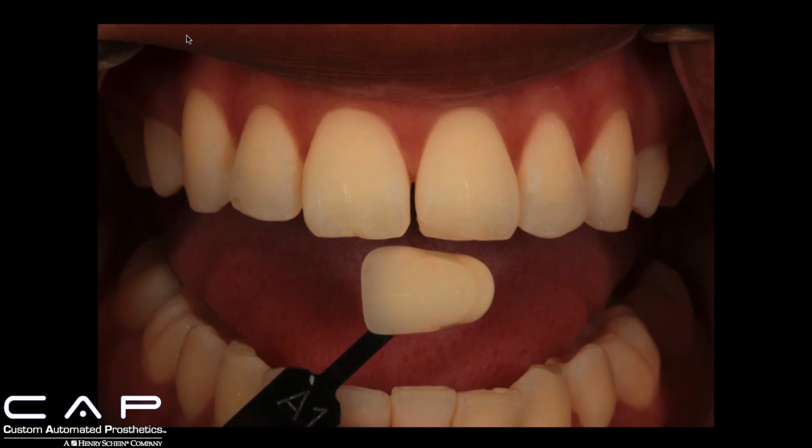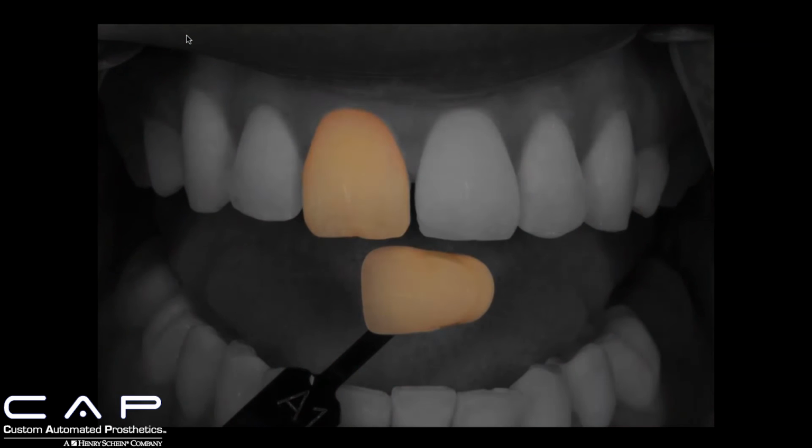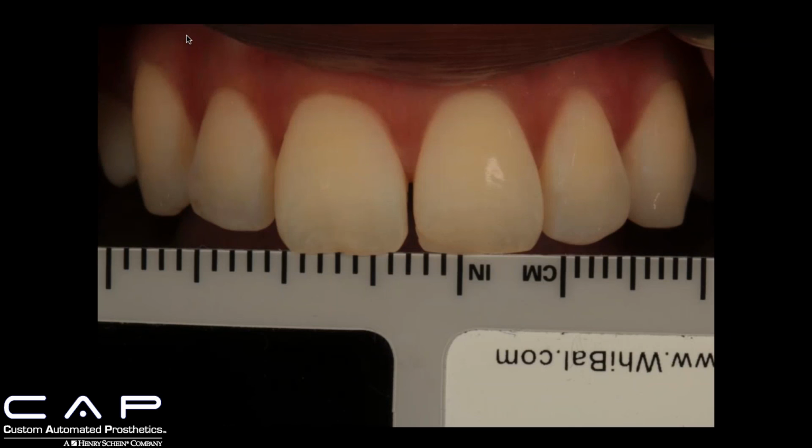So it's really important to position that right under the tooth. I don't like to have it touching the tooth because then it's affecting the incisal edge and that translucency. You're providing a sort of fake halo effect. So it's important to have it just under the tooth, but positioned right under to where it's in line with the other teeth.